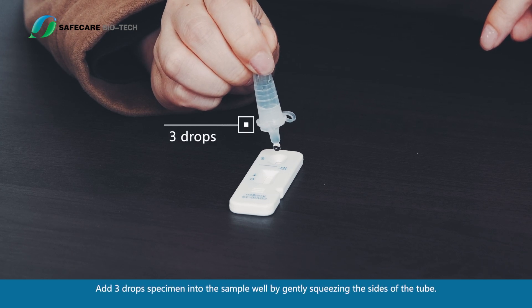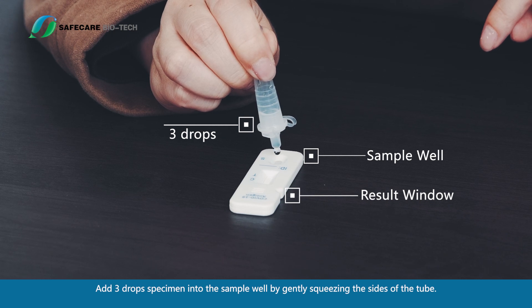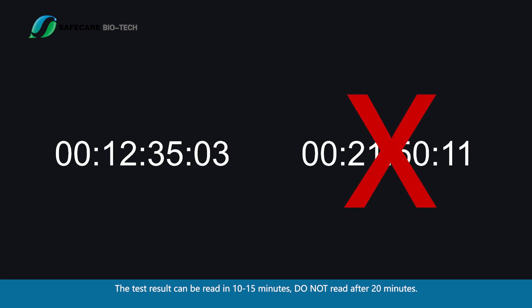Add 3 drops of specimen into the sample well by gently squeezing the sides of the tube. The test result can be read in 10 to 15 minutes. Do not read after 20 minutes.